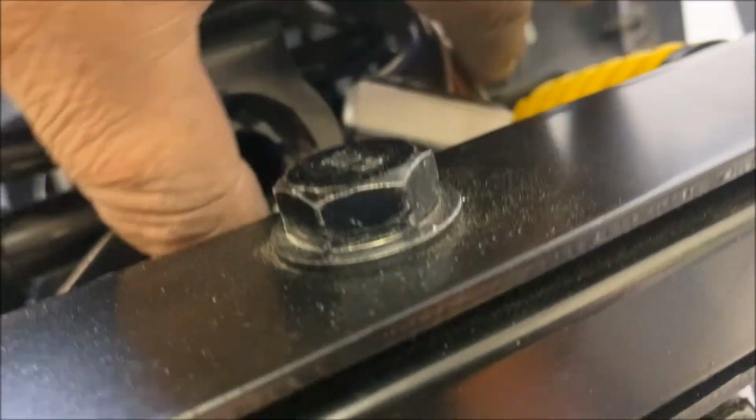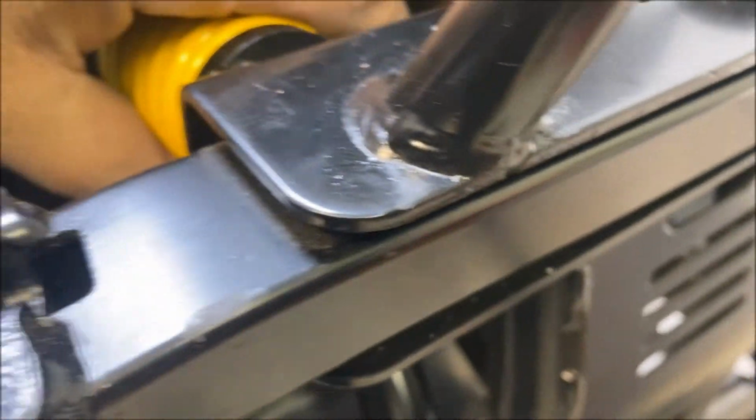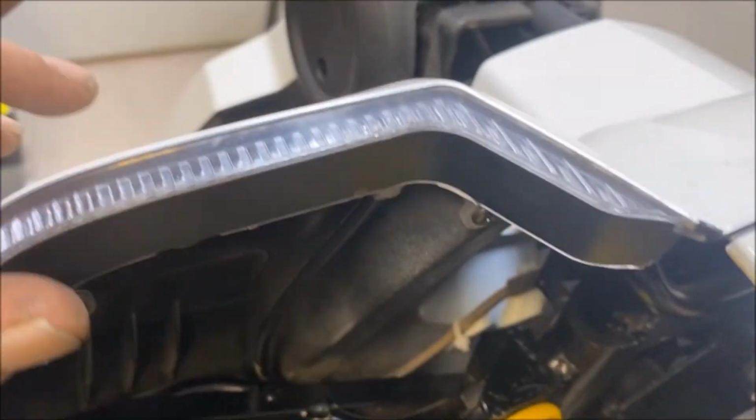Just be careful, there's a plug socket just there, and also 2 behind this plate here. If I can get in and show you. Yep, 2 there. So don't get this wet. Don't go tramming through puddles or rain or anything like that, because it could damage that steering detection. Plus there's also the wiring for the lights, for your turn signals there.